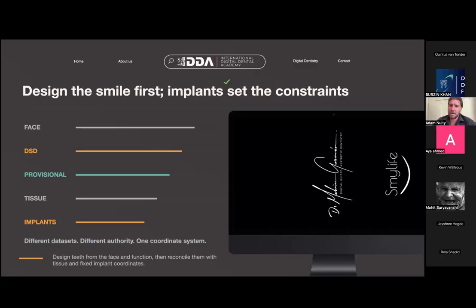And so one of the main aims of what I've done with ScanLadder is given you the ability to really be able to capture data sets and align them better, not just capture one data set accurately, but to accurately combine those. And we'll talk about this a little bit more.